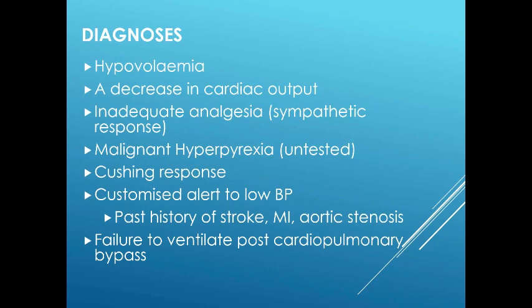Inadequate analgesia is inferred from a sympathetic response. Again, significant changes in blood pressure, heart rate, and pulse volume. The MAC value of the anaesthetic mixture is assessed, taking into account the age and temperature of the patient.